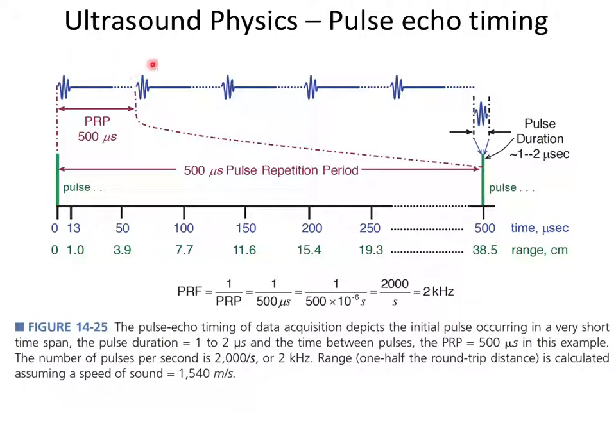So we have these pings that are coming out of the system, ping, ping, ping, ping, right? Like so. And then when we're not transmitting in this time, we open up the system to receive echo information. So we go ping, listen, ping, listen, right? And this is saying it's about half a millisecond of listening time here, just for this example.